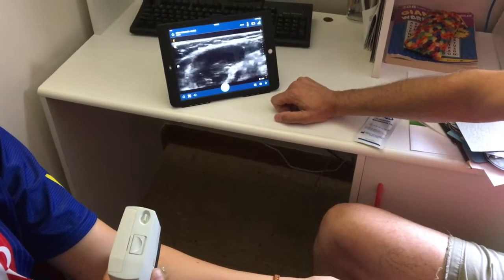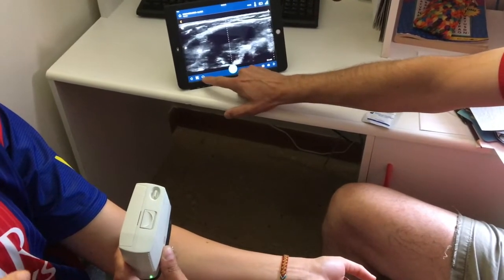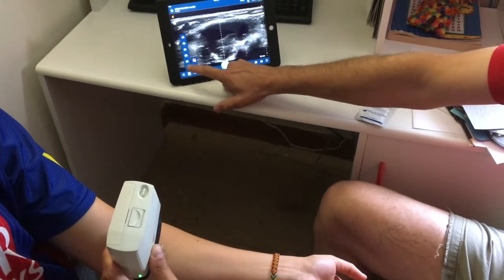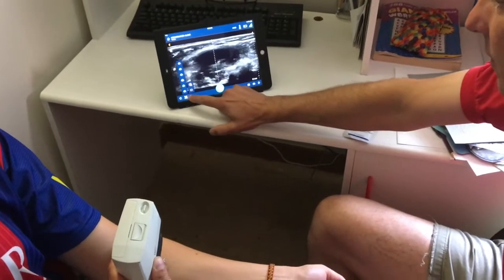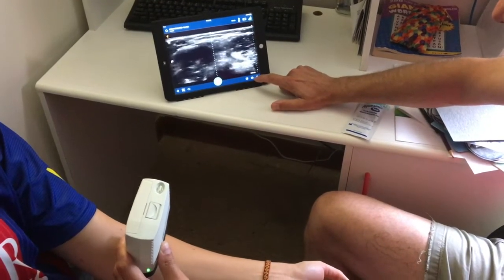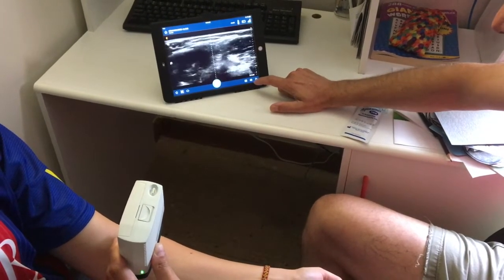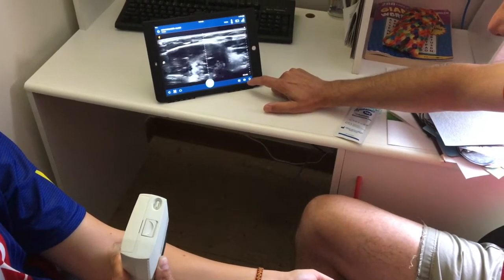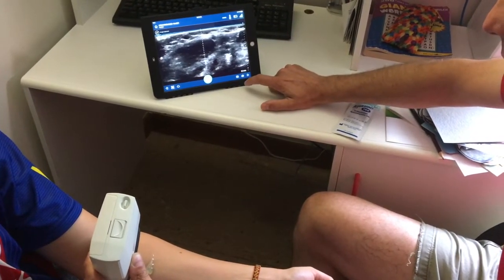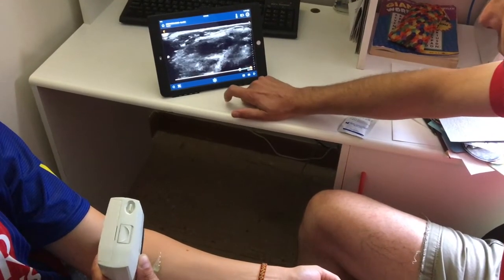We can touch here to get our center line, and touch here to switch to M mode. We can shoot a still photo, capture an image, capture video, and then freeze the image here.